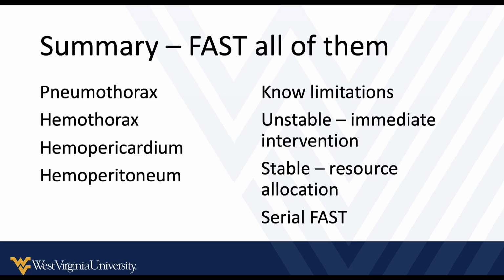And then lastly, don't forget, in a patient with ongoing instability, repeat the FAST exam if the first one was negative, or even in stable patients whose symptoms are ongoing, or just as part of your evaluation, you can do serial abdominal exams and serial FAST exams to help you make decisions in some of these complex patients. I think that's everything I've got for you here on the FAST exam and trauma.